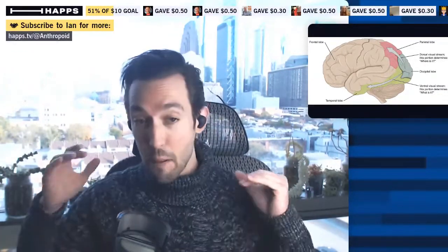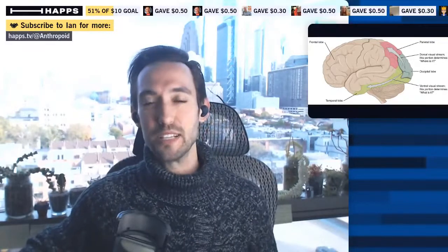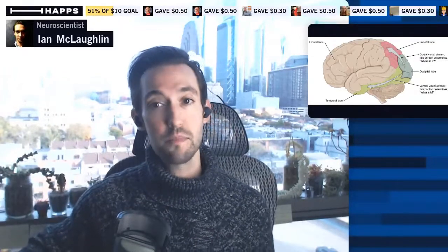That's pretty awesome. I would absolutely expect that there would be at least a bit of a recovery process, like ice cream and comfort movies for at least a week. I would demand that. But anyway, this group based the way that they stimulate using that implant on an interesting strategy. They were learning how the human eye sends signals to the visual cortex by literally measuring signals from the eyes of recently deceased organ donors.